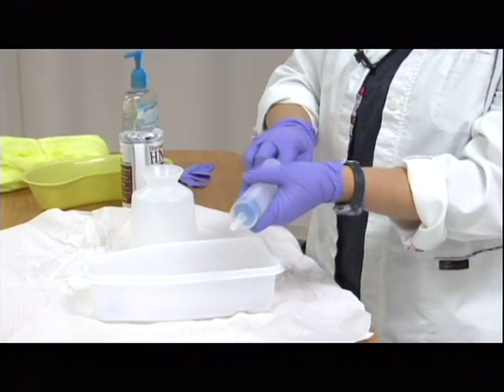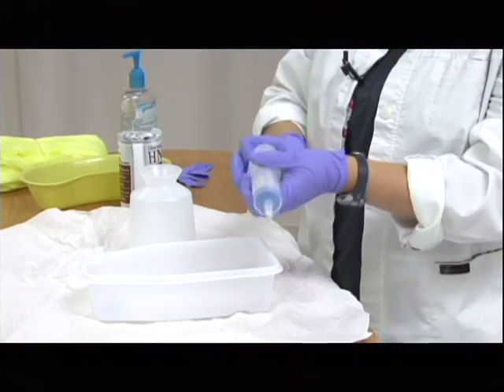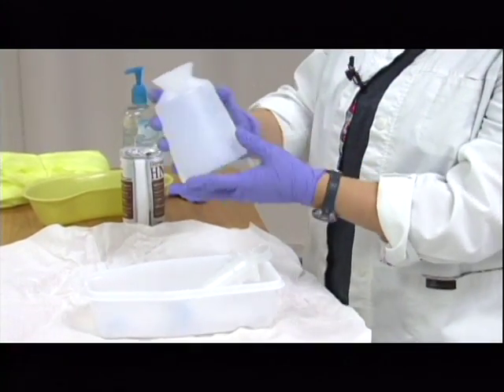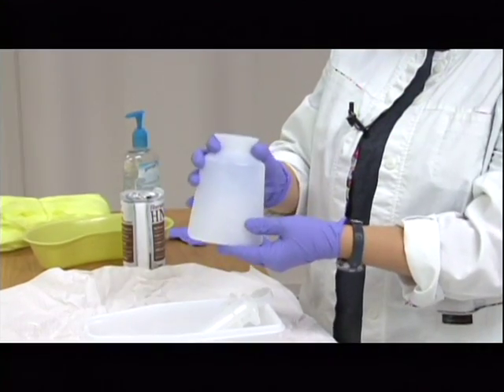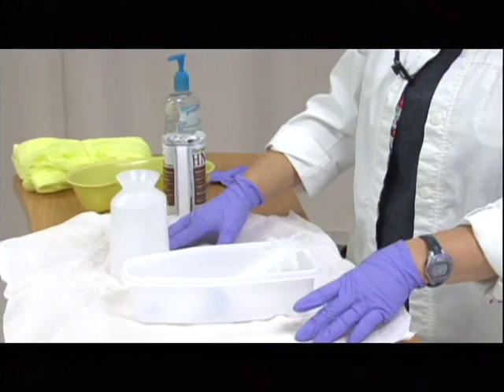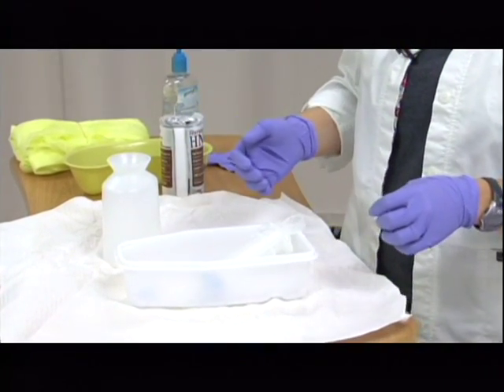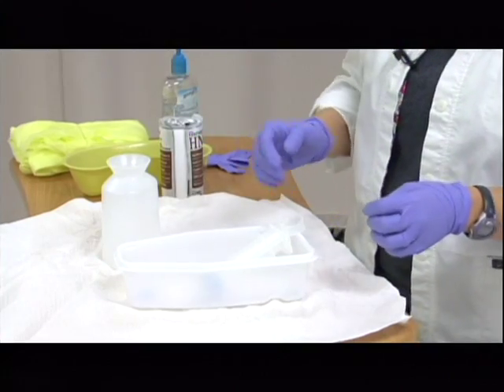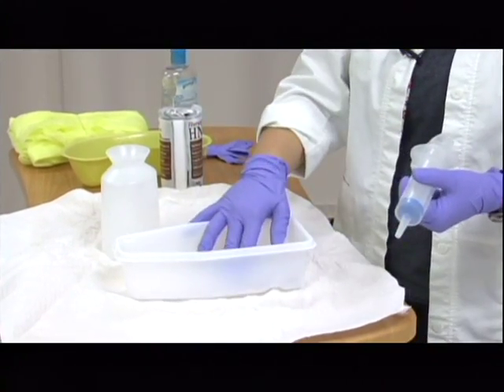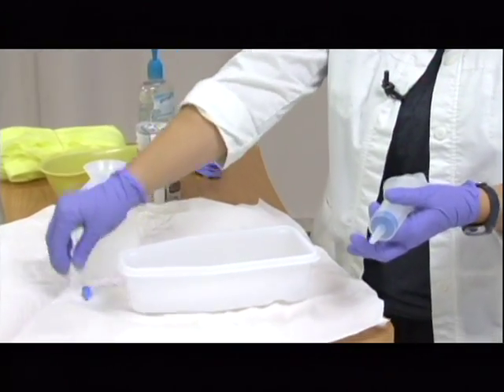I usually manipulate the syringe a little bit because if this is the first time it's been used, it may be hard for you to pull it and move it. And then I'm going to go ahead and look at my container, and this is what I would put my warm tap water in. So we're going to say that I've already got some warm tap water in here. Now this depends on facility policy for what you need to flush your tube with, as far as after I've checked residual and all that. Typically, you are going to use this tray to hold your residual if you get any. So I might well want to move the little cap over here to the side so that it's not in the way.